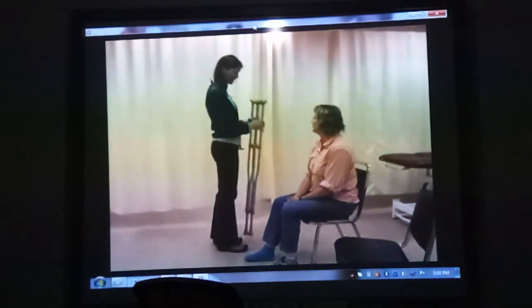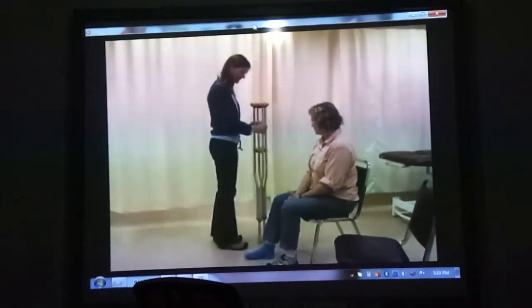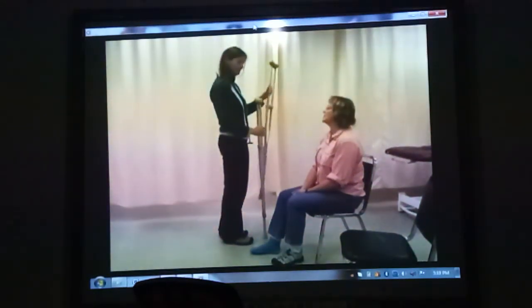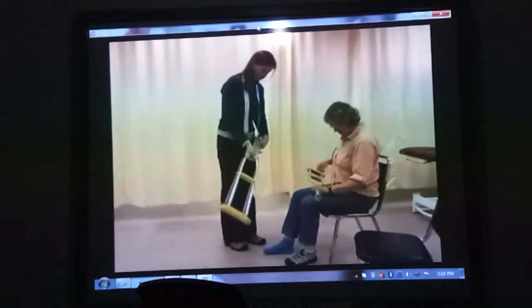I'm going to help you learn how to use the crutches today. Okay. And the doctor had said not to put any weight on your leg. Is that true? Correct. Okay. Do you mind telling me how tall you are? I'm 5'6". Could you help me out? We're going to adjust these. All you have to do is push in that button.